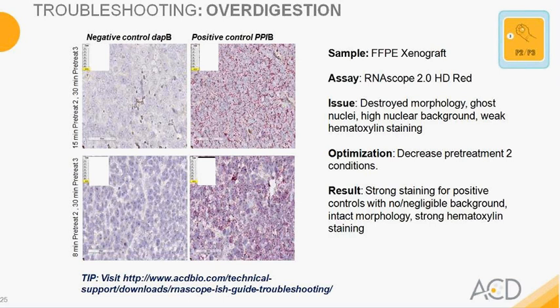These are some of the tips that we would like for you to follow when you're working with your assays and your samples, to observe the background, the nature of the background, and understand how to resolve these particular issues. We have a technical troubleshooting guide that you can find on our website, and this is a new item that we would like to direct you to when you're performing your troubleshooting.